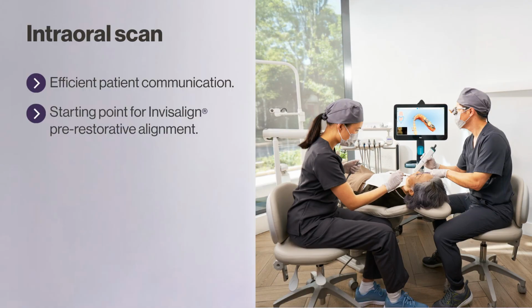Depending on the practice, the scan can be taken by different staff members during a preventive consultation with the dental hygienist or by an assistant before the doctor's examination. iTero's technology is designed for a quick, easy, and comfortable procedure both for the dental practitioner and for the patient.